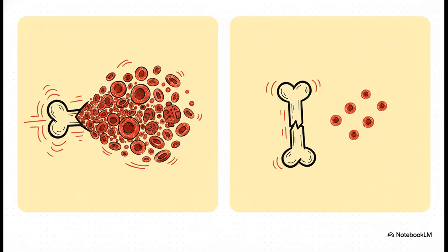Now, contrast that with the right side, non-regenerative anemia. The MCV, MCHC, and RDW are all completely normal, but the red count is dangerously low. This is the alarming, classic signature of bone marrow failure or a complete lack of signaling.